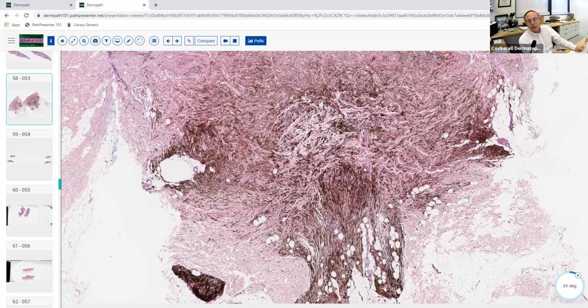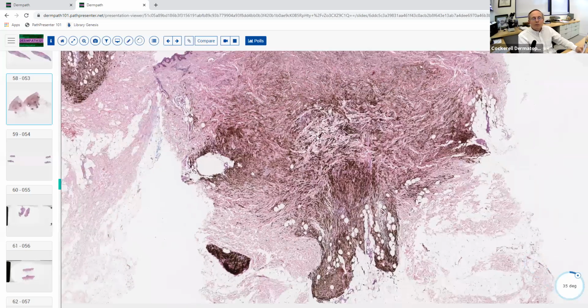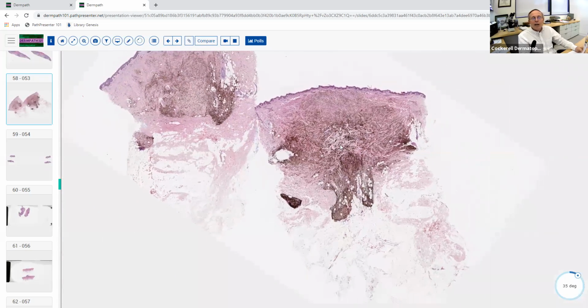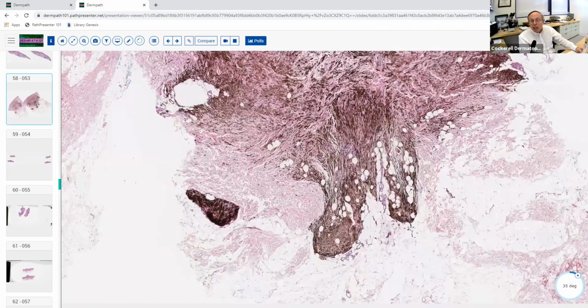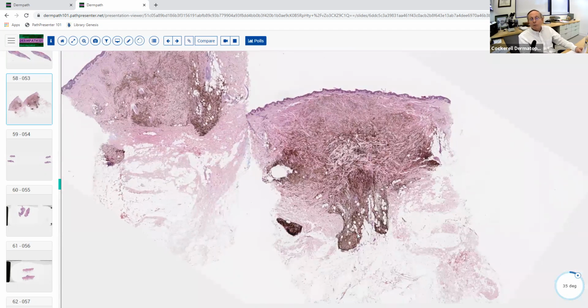And then finally, metastatic melanoma. Well, it's clearly not that either. Okay, that would be a round papule in the skin. So that's absolutely not metastatic melanoma. So that's a deep penetrating nevus. And these classically will kind of have this deep tongue of heavily pigmented melanocytes that go all the way down into the subcutaneous fat. That's why they're called deep penetrating nevi. It's really a subtype of blue nevus, is really what it is.